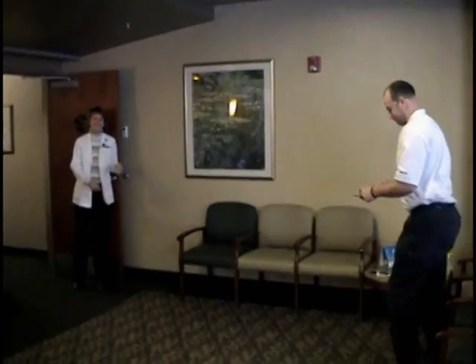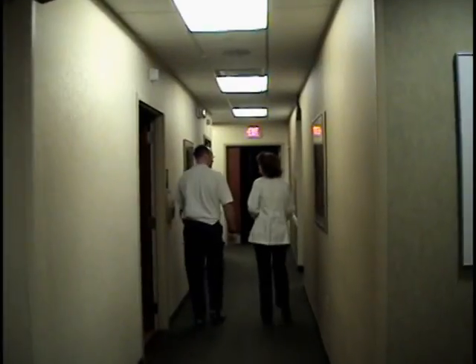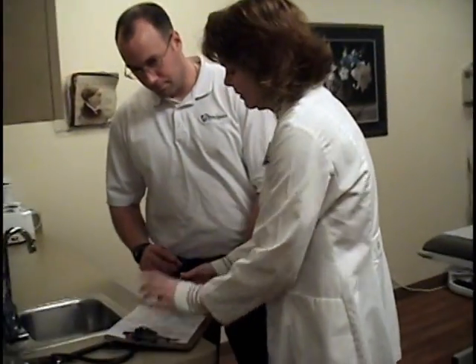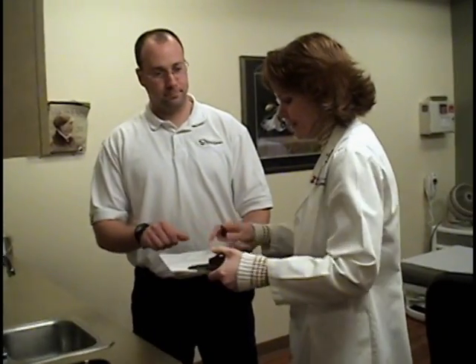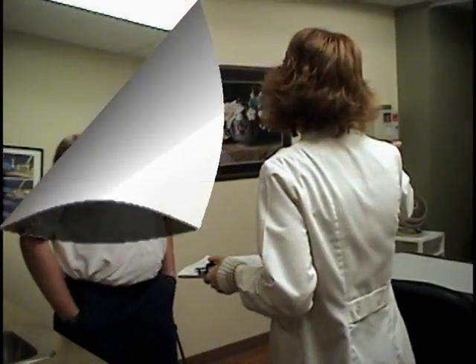When a room becomes available, our staff will guide you to where your stress test will take place. They will review the questionnaire with you. Please ask any questions at this time before you sign the consent. You will then be given an opportunity to change.